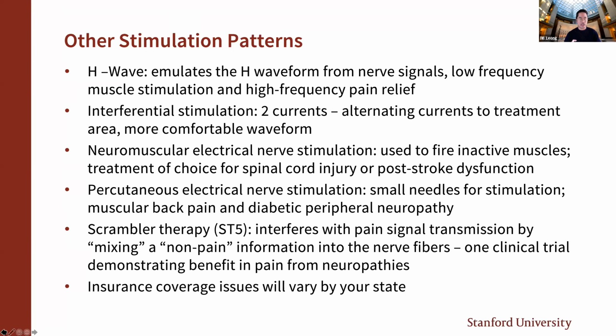And it seemed like they were sort of a spin-off of TENS units that are just a little bit more comfortable, with a little higher frequency and a more comfortable waveform, or they just seem to have a little different pattern that's better for certain people than a TENS unit itself. A TENS unit tends to be kind of a tingly, tapping type sensation that can be uncomfortable for some people over a period of time. And I think these two at the top actually tried to smooth out the delivery so it was a little better.